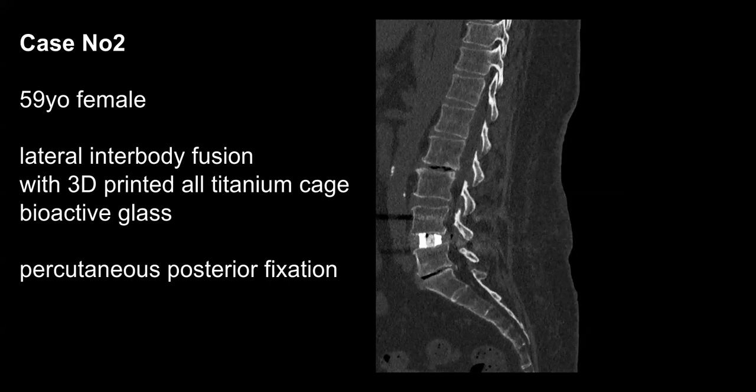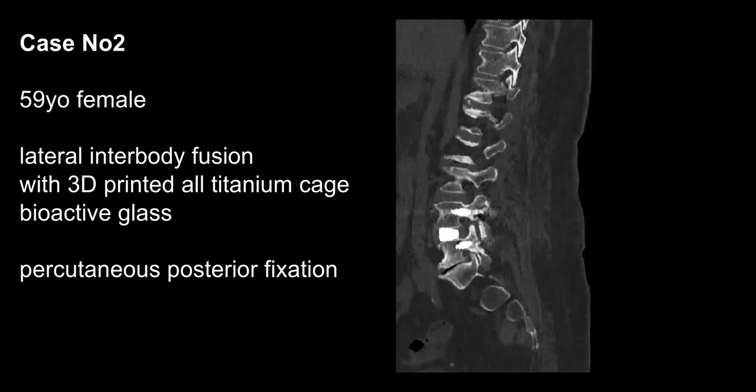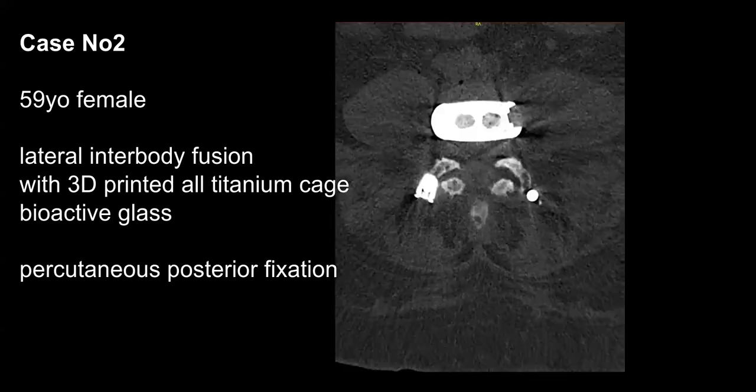The patient didn't have any problems due to the access, so no pain in the thigh, no new neuropathic pain. She was very fast on her legs. She was ambulatory within 2 days. We don't do these as ambulatory here. It's always an inpatient setting here. And he placed this cage very nicely.